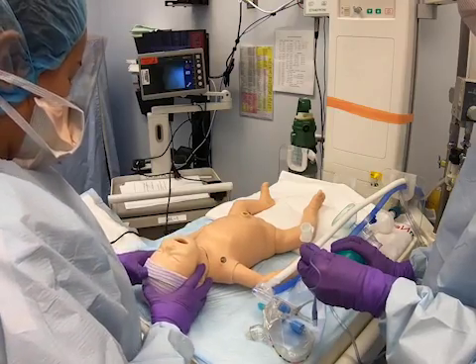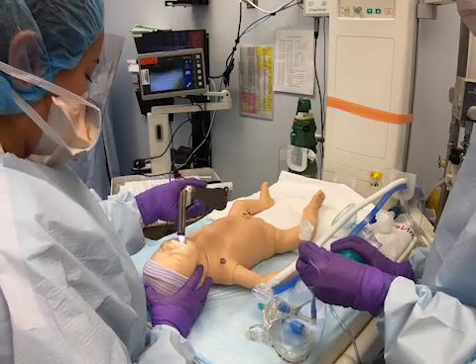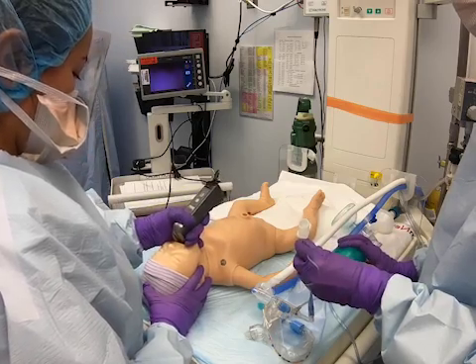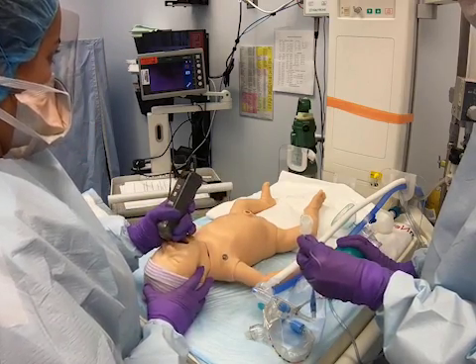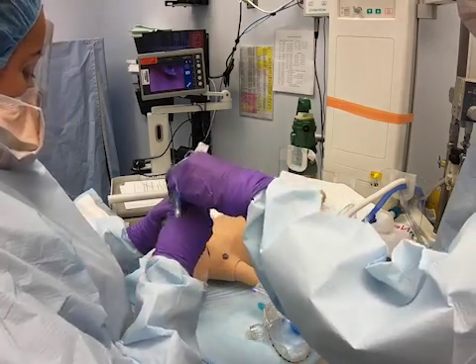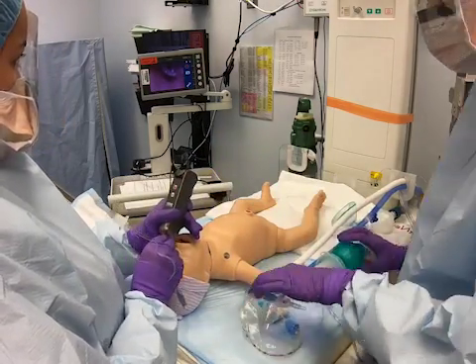For endotracheal intubation, use a video laryngoscope device if possible. This will allow the intubator to maintain a safer distance from the baby. A cuffed endotracheal tube is used for this patient group to maintain a closed system.